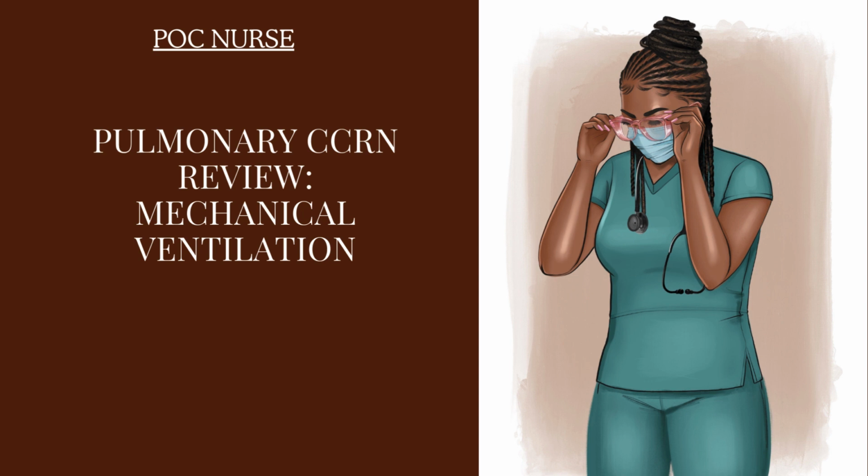We spoke about PEEP already as being one of the settings that's used to help in gas exchange in the patient that's mechanically ventilated. So if we want to make sure that the patient is oxygenating well, we would manipulate the patient's PEEP and FiO2.